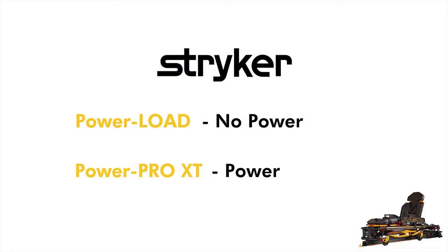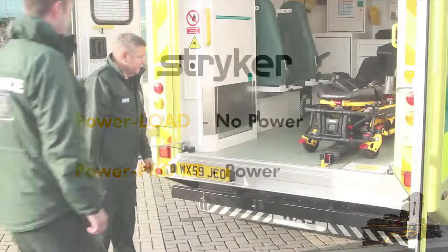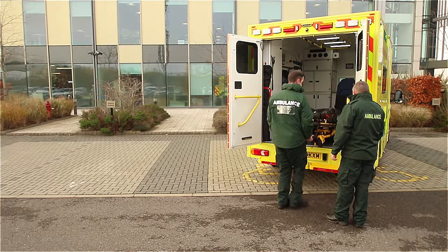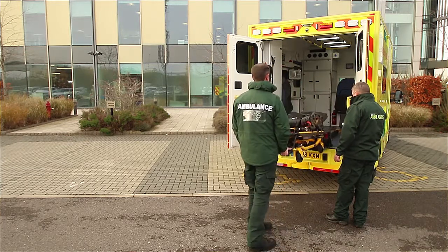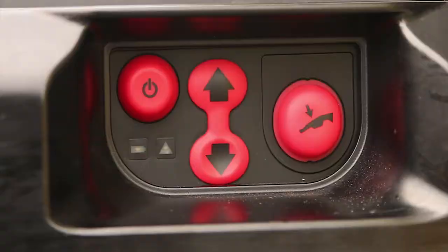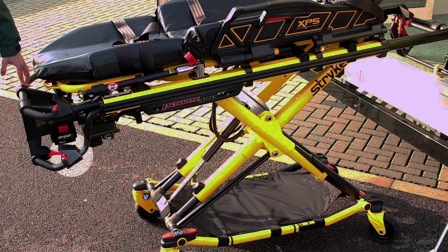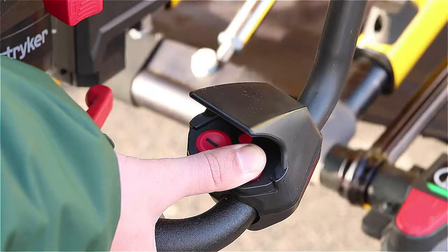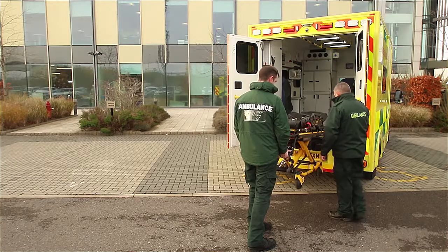In this scenario there is no power to the PowerLoad — therefore no LED lights are displayed and no lights showing on the side. To unload the stretcher, press the red backup release lever at the foot-end of the stretcher and guide the stretcher out of the vehicle until it comes to a stop. One operator needs to support the stretcher at the foot-end while the other operator locates the control panel on the side of the PowerLoad system. Locate the plus button on the stretcher control panel.